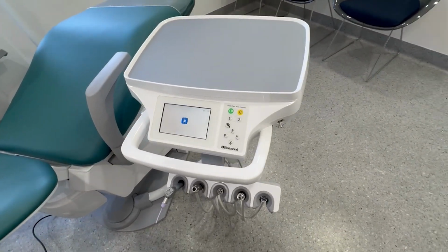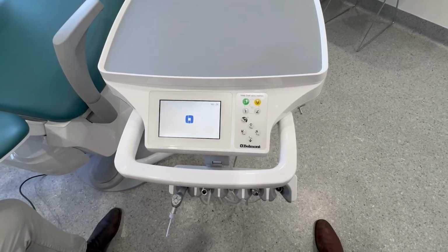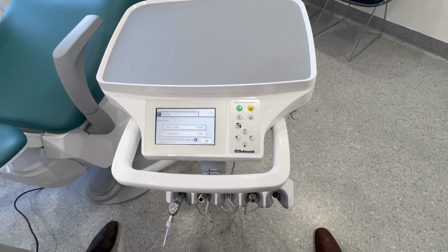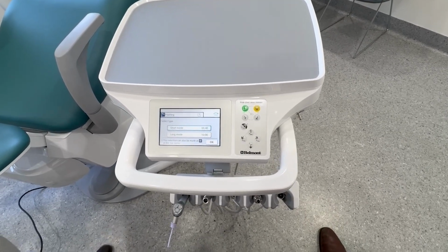We're going into this boot-up phase here, you can see at the moment. Just let it go through that. Don't touch any of the hangers or anything like that, or you're going to put it into an error. You're going to lock out hangers and things like that. So let it do its full boot.